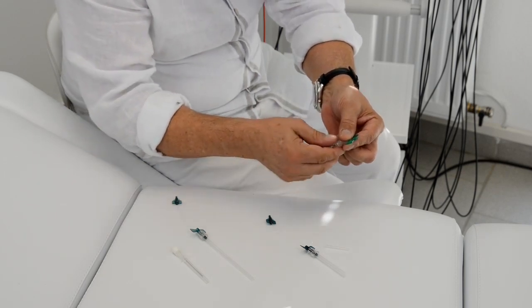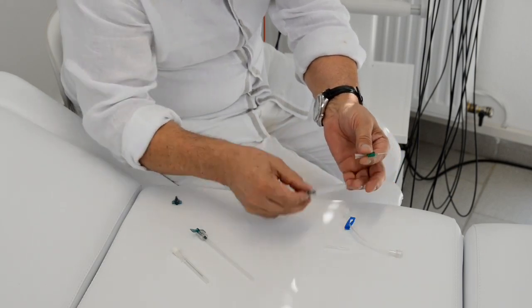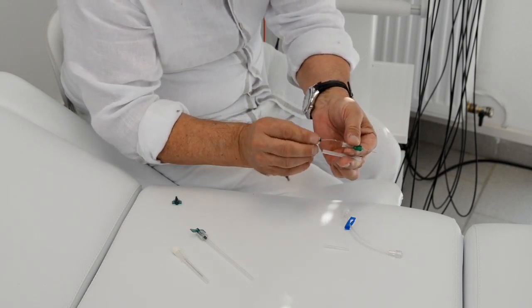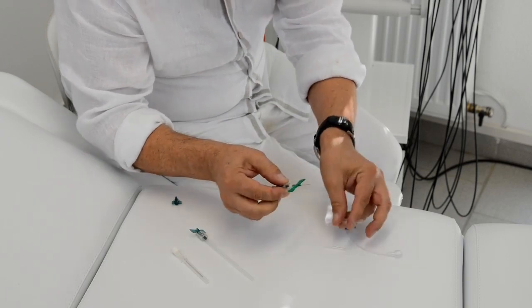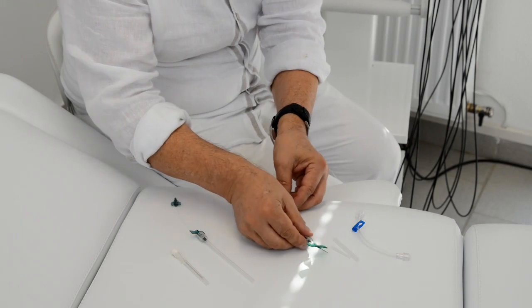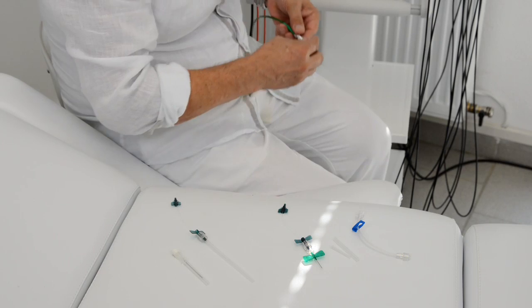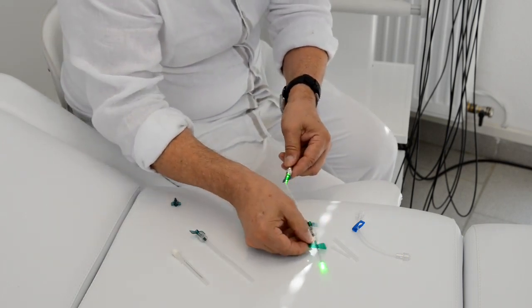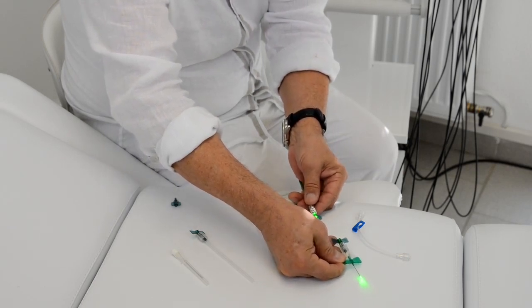When this is done, I can disconnect the extension tube and put in the sterile plastic catheter, a little bit turning, then it's jumping inside. And now this system is ready for intravenous treatment. And now I will connect it with our lasers, maybe a green laser. And now you can see that the laser light is coming out right on the top of the needle inside the bloodstream.